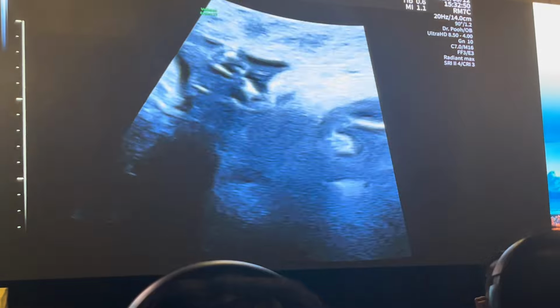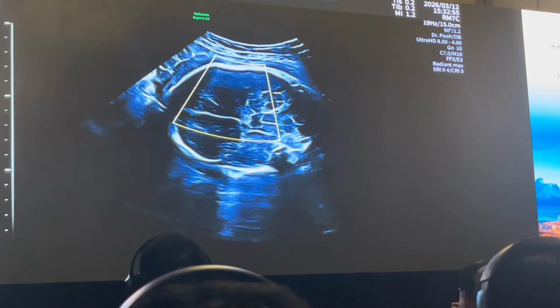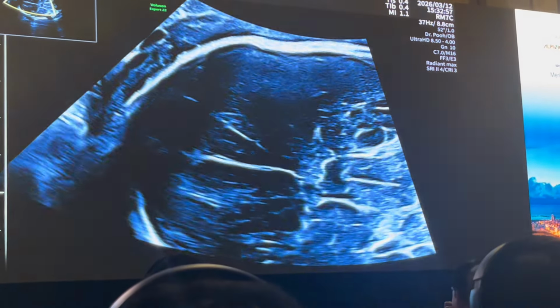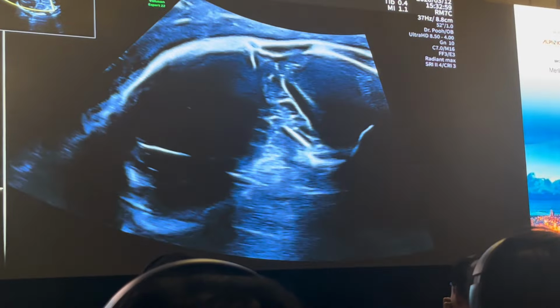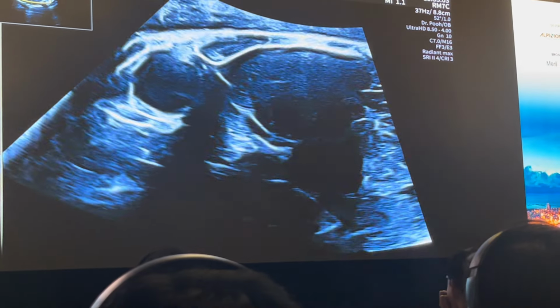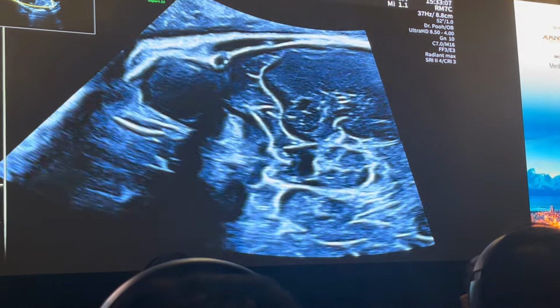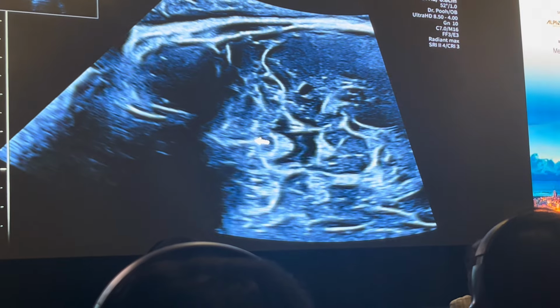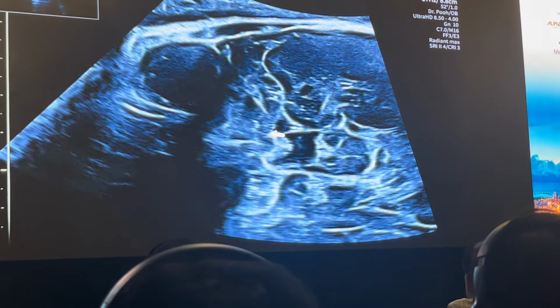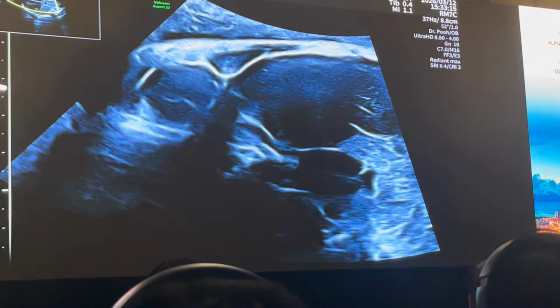When you are looking for the optic chiasma and you're trying to see the anterior optic tract, you're trying to bring in the chiasma and the orbit in the same view. So you catch the orbit and then you catch the optic tract. And this is the point where, from the optic chiasma, you will track the anterior part of the optic chiasma heading up to the optic nerve.